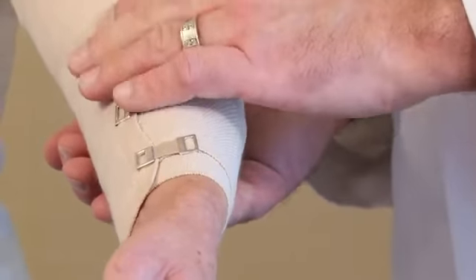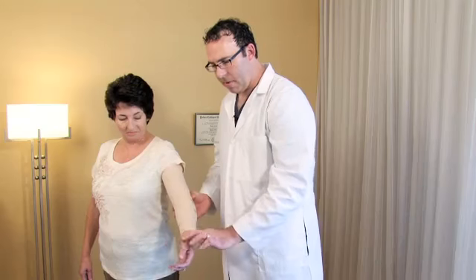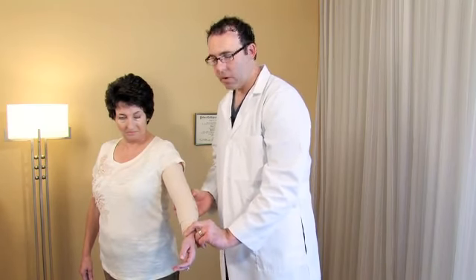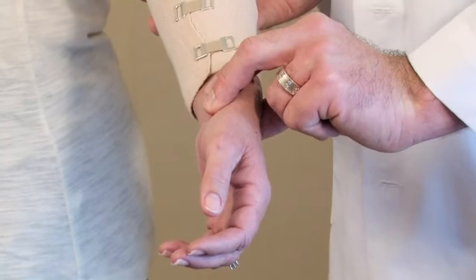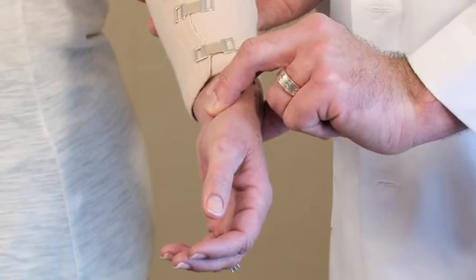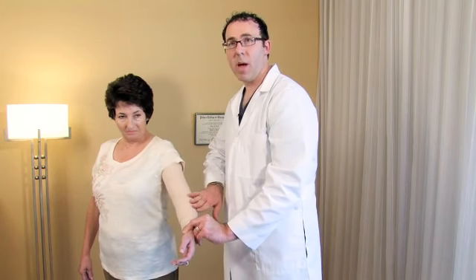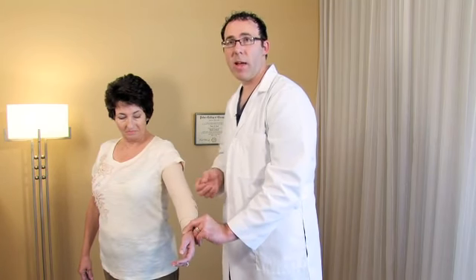The most important part you don't want to forget: come off of the thumb where the thumb connects to the wrist and just feel the pulse with your first two fingers. If you can feel the pulse, you're good to go. If there's no pulse, that means you wrapped too snugly and you've reduced the circulation — immediately take the wrap off and redo it with lighter wrapping.